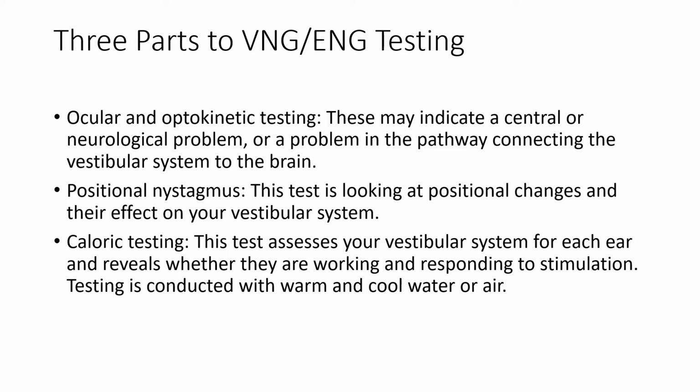And the third one is we call caloric testing. So this test assesses your vestibular system for each ear and reveals whether they are working and responding to the stimulation. This test we conduct by using warm and cool water or air.